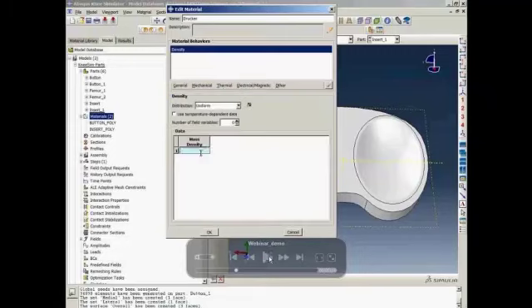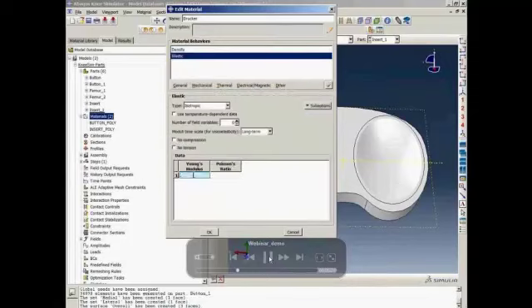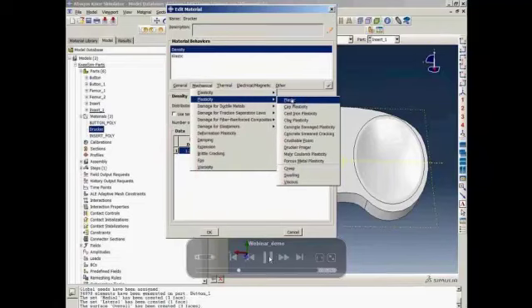As I mentioned, since Abaqus Knee Simulator uses Abaqus Explicit as a solver, we require the user to provide the mass density for each material. Enter the elastic property. Here, I just want to mention that because Abaqus Knee Simulator has the built-in geometry and materials for the soft tissues, we do have a built-in unit system. It is the SI units, so the force will be in Newtons, the pressure and modulus will be megapascals, and the length unit will be millimeters. Drucker-Prager plasticity.